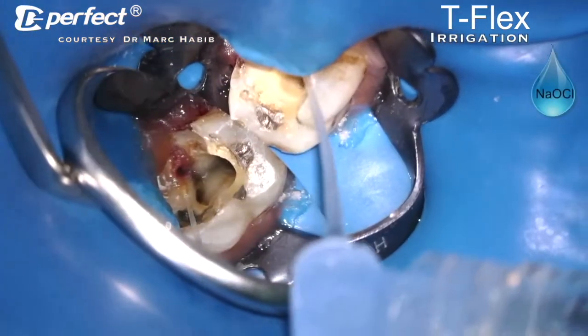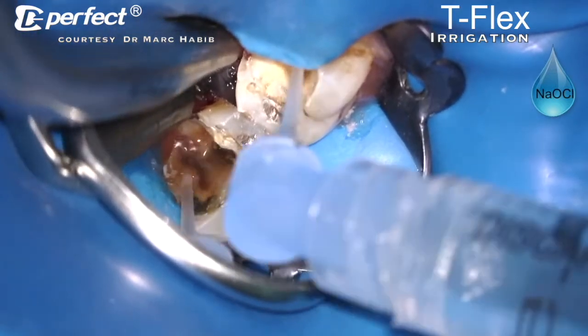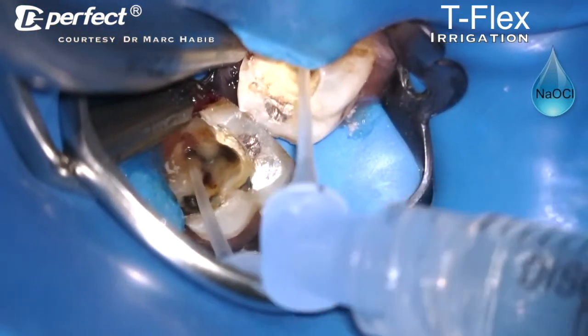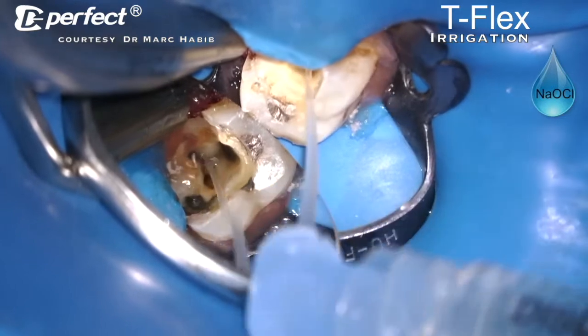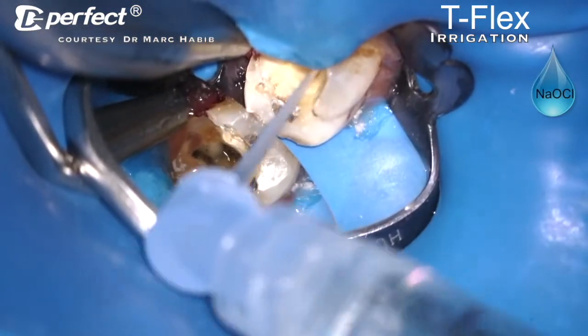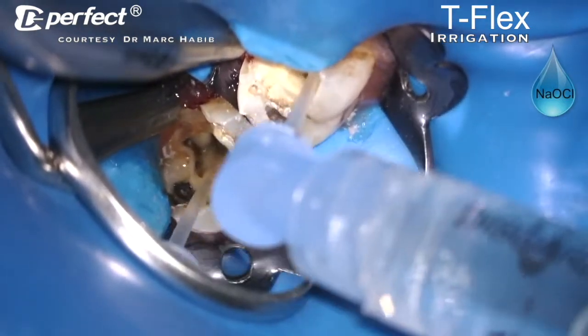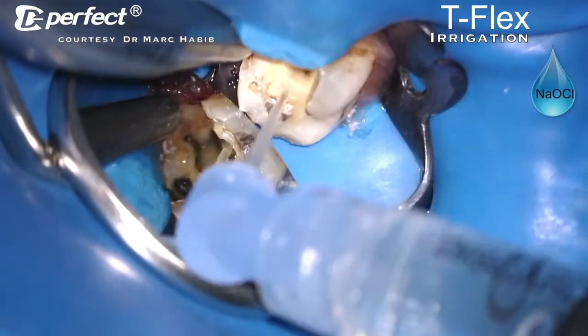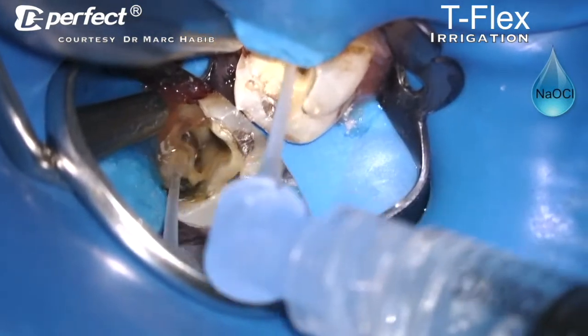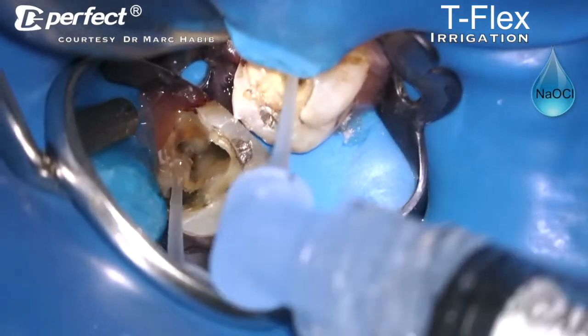Once we have the glide path done, we go ahead and do our irrigation. So now the access is very easy for bigger files, for the shaping files. So we have the glide path in all 3 canals. Now we can go ahead and use the shaping files.